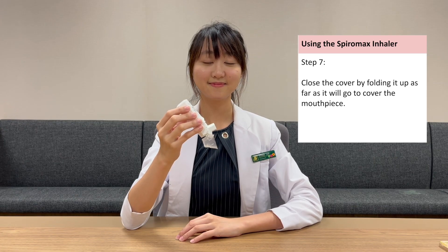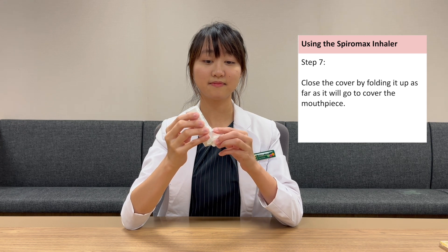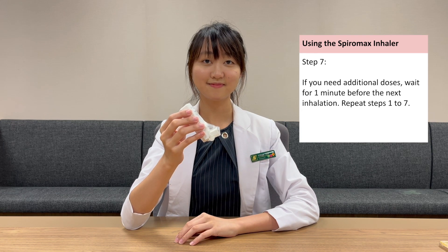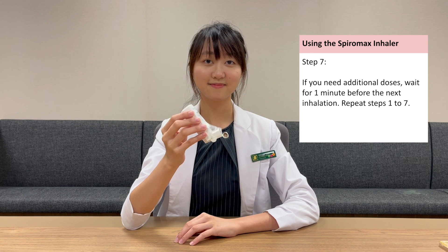Close the cover by folding it up as far as it will go to cover the mouthpiece. If you need additional doses, wait for one minute before the next inhalation. Repeat steps 1 to 7.